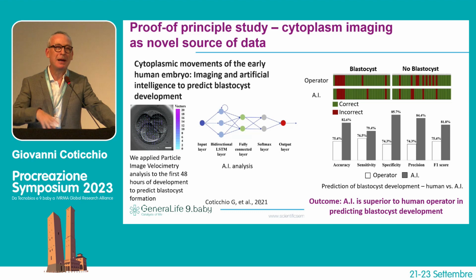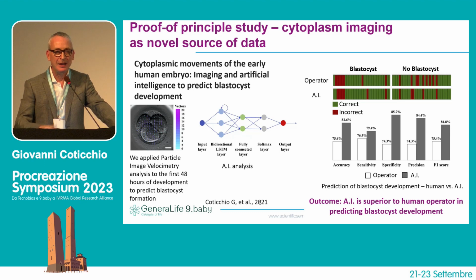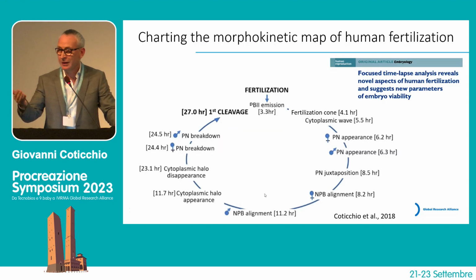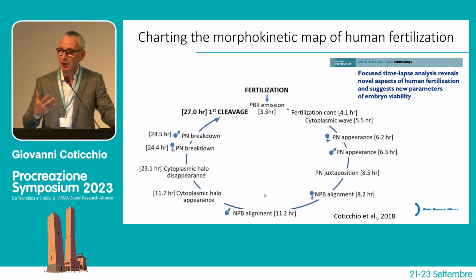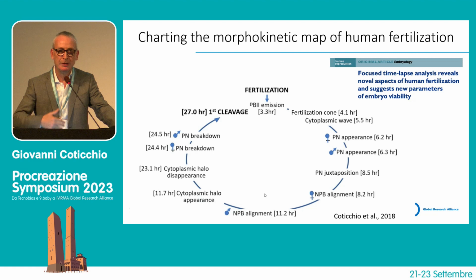By time-lapse technology, we can access novel types of data and novel approaches to embryo analysis, also for clinical purposes. But basic observation is equally, I think, fascinating, and it can promise the possibility to develop new approaches for embryology.